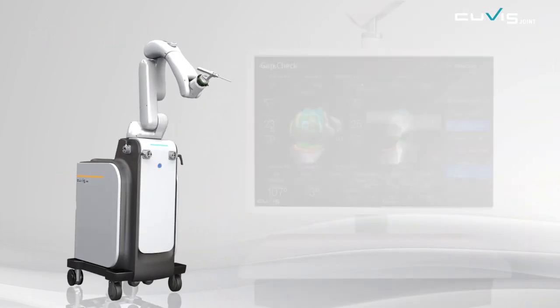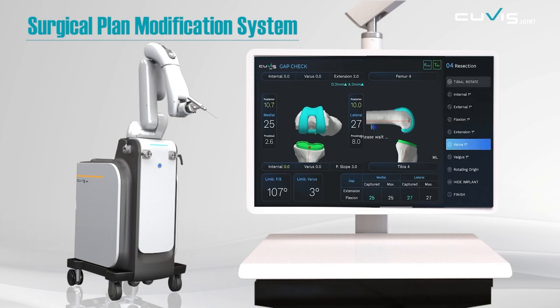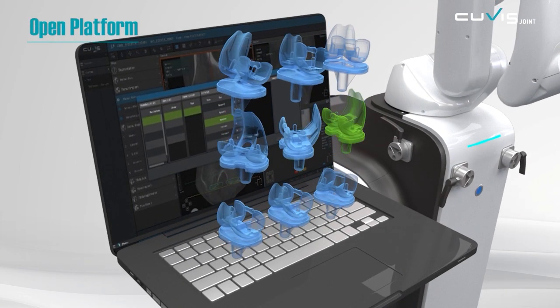You can flexibly change surgical plans before and during surgery, which leads to the most optimal surgery for the patients. As an open platform, QVIS Joint offers a wide and free choice of implants for the surgeon.